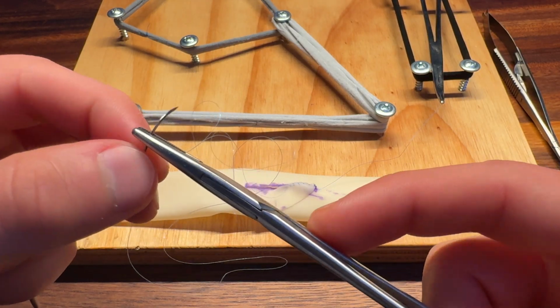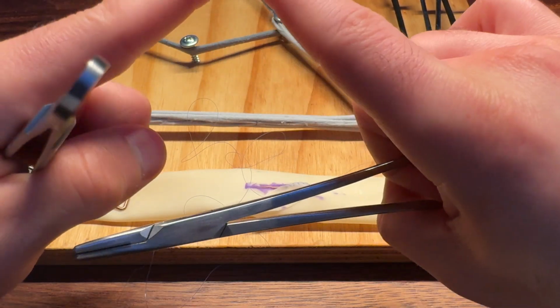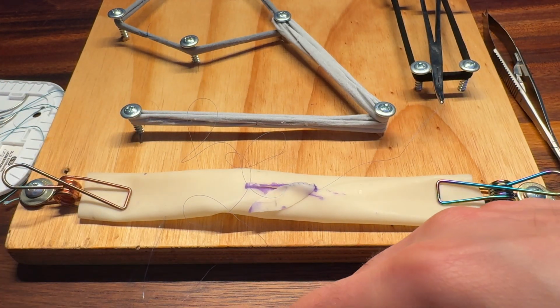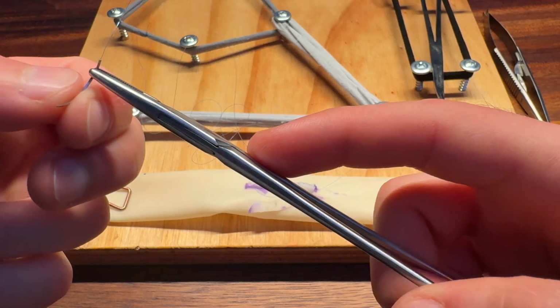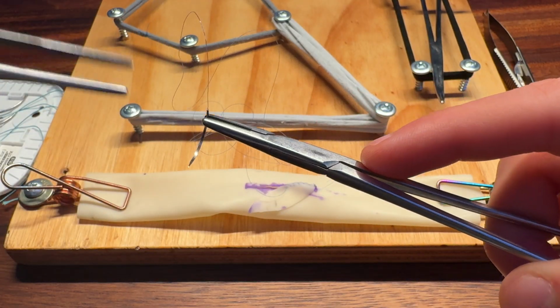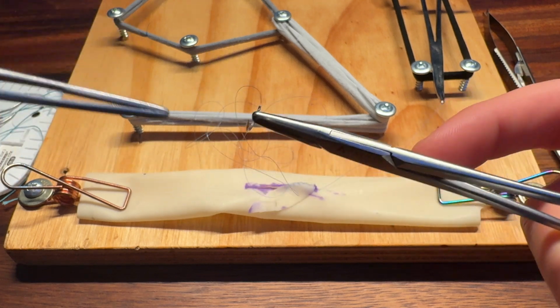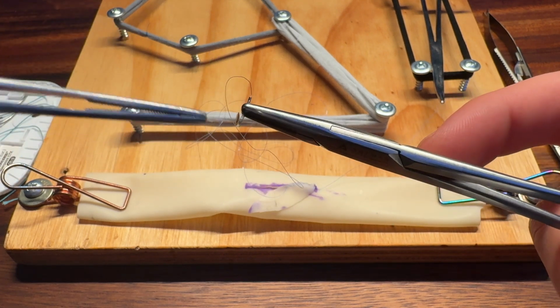Essentially, the cutting needles have a bit of an edge to them, like a little bit of a triangle. And depending on whether the triangle's at the top part or the bottom part of the needle, that dictates whether it's reverse or regular. In this case, we have a reverse cutting needle because this top side of the suture is nice and flat. The bottom part has the triangle, right?